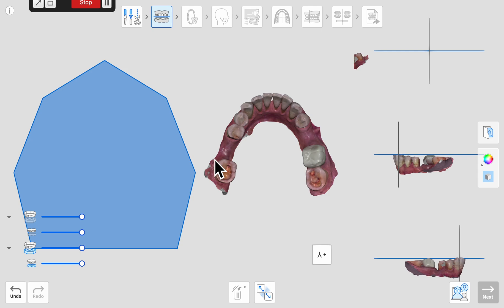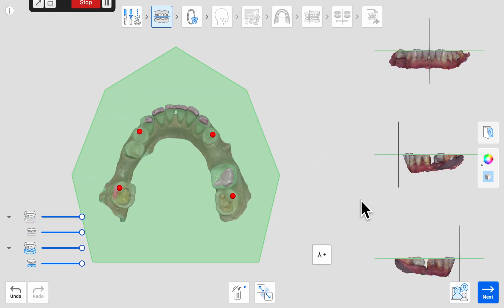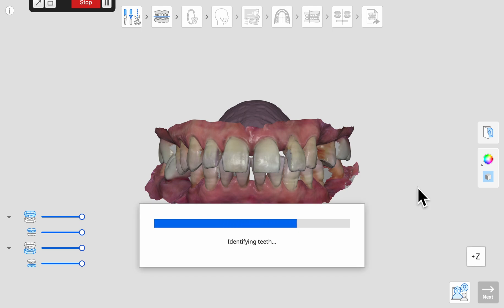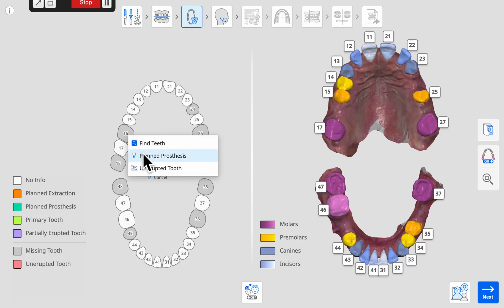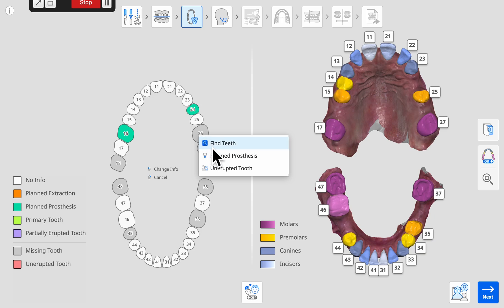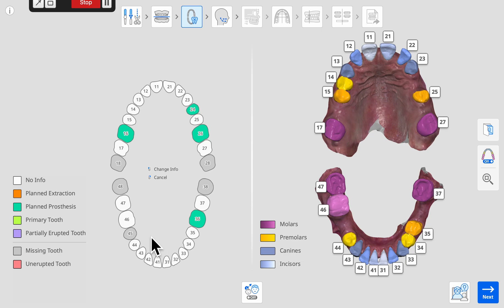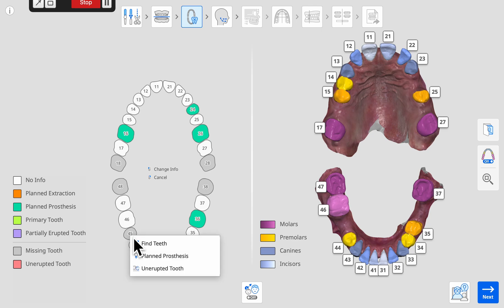After using an intraoral scanner to create digital models, four symmetrical points are placed on the model to determine the occlusal plane used for aligning the teeth in the vertical dimension. The existing teeth are automatically identified and numbered. We then indicate which of the missing teeth are being considered to replace with a prosthetic restoration.